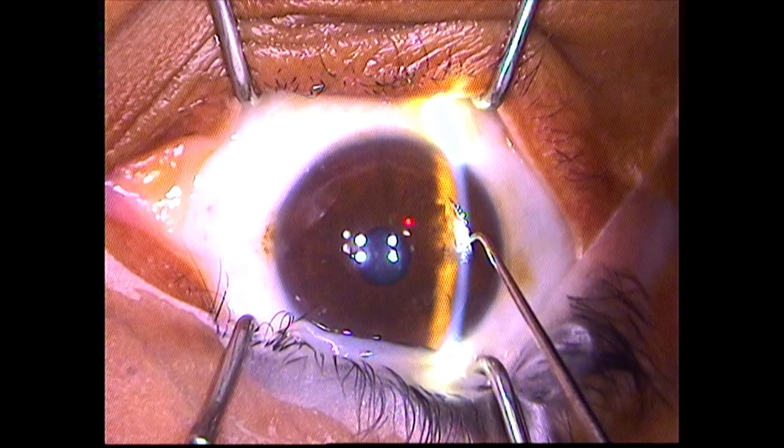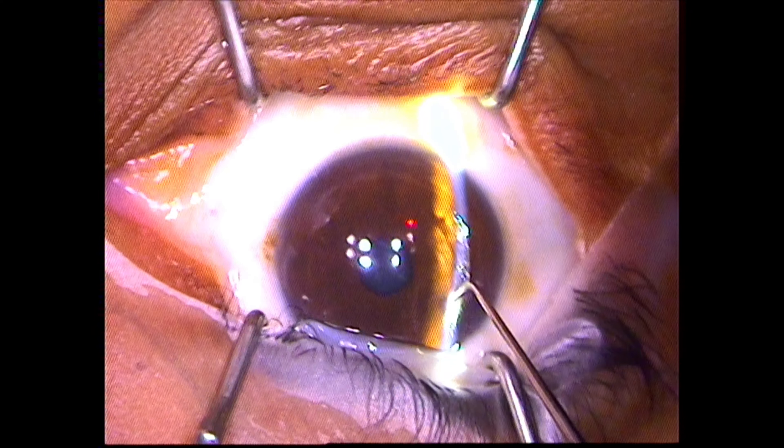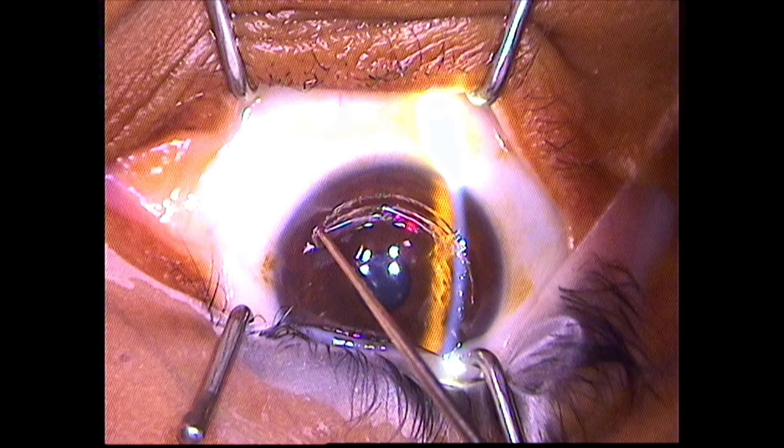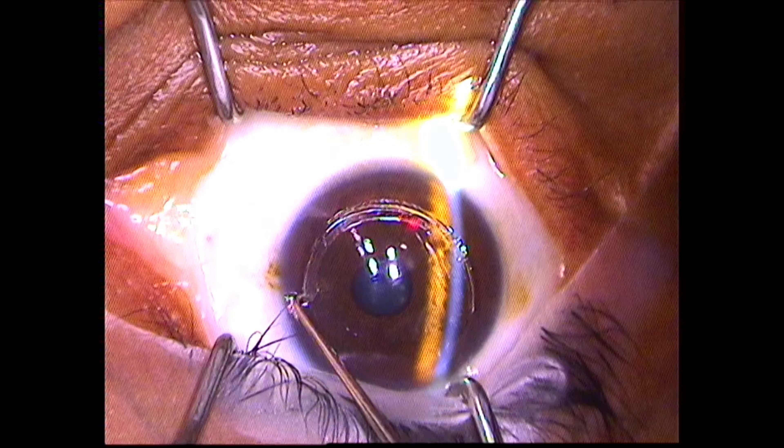The patient's eye is draped and a slit beam of light is used to find the edge of the LASIK flap. An instrument is used at the edge of the entire flap to break the adhesions from where it had healed previously.